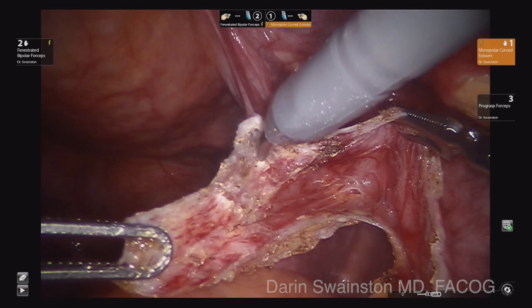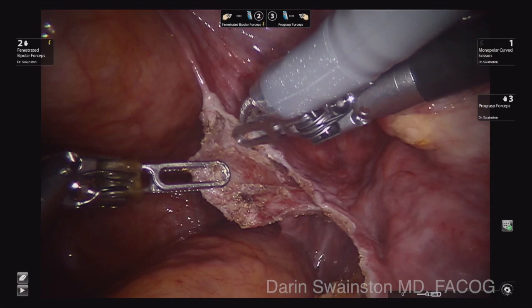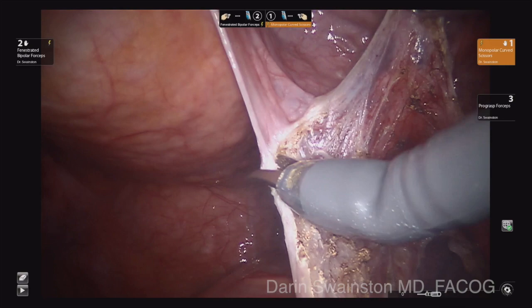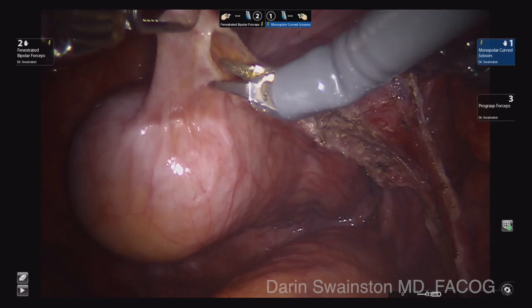You need to really open this up enough so that you have enough peritoneum to cover the mesh at the end of the case. I am using both instruments to stretch this area out and see clearly where I want to go. In this area you start getting close to where the uterosacral ligament is and sometimes it will get a little woody or difficult to dissect. Just be careful not to damage that uterosacral ligament any more than you need to — take down just enough so you can cover your mesh at the end of the procedure.